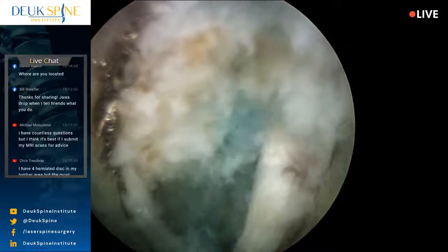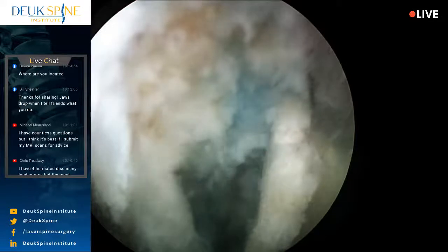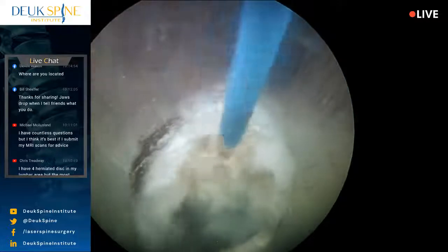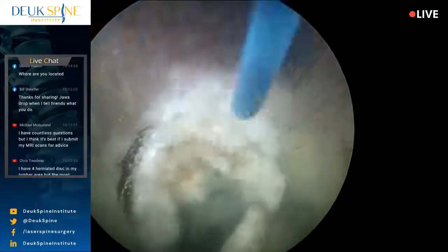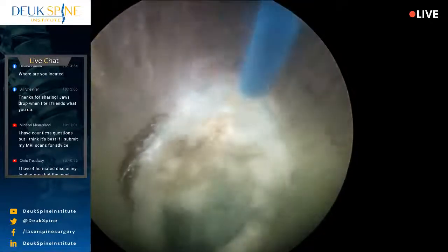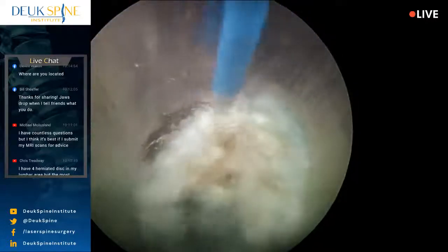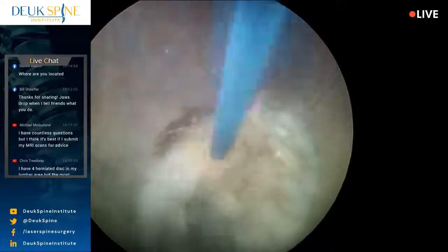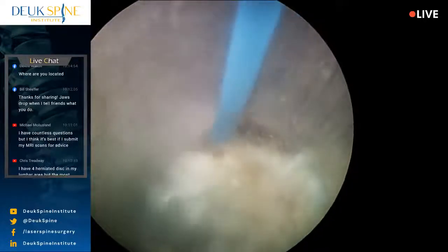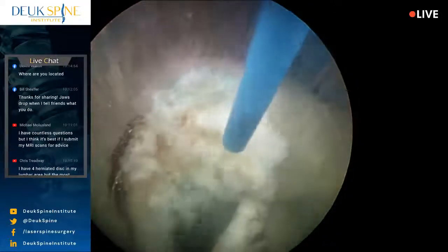All right, I've grabbed out as much as I can. I'm going to use the laser again. And this is taking a while because there's so much scar tissue here. Scar tissue takes a long time to zap away with the laser. Unlike normal nucleus that's not scarred from inflammation, that normal nucleus is easy. It just melts away like butter on a hot knife. But the scarred up nuclear material is just so thick.